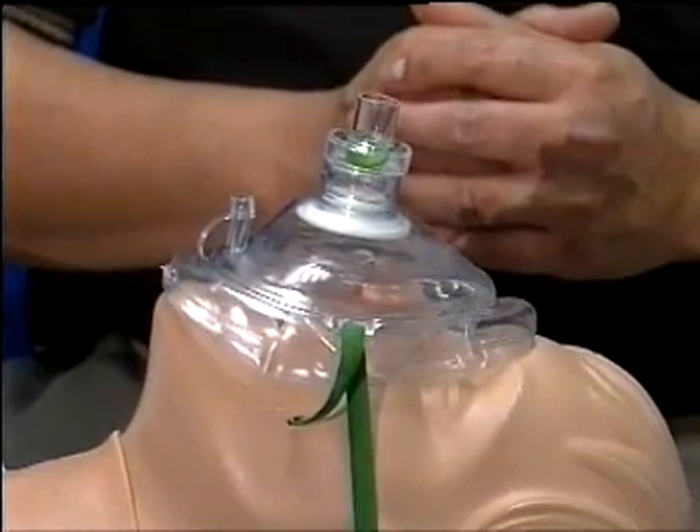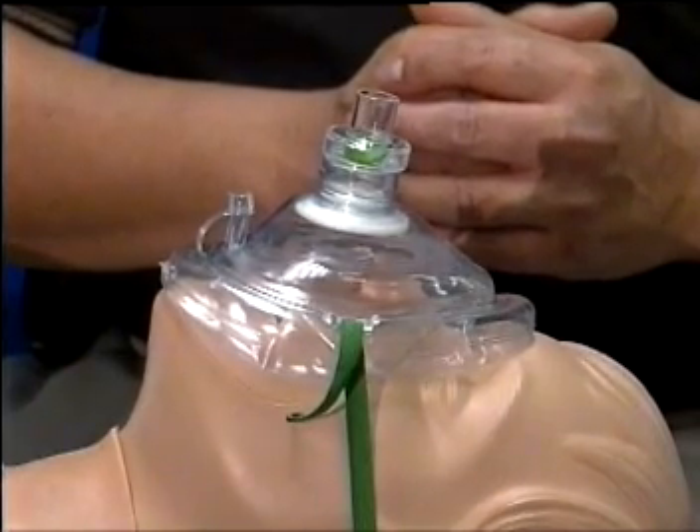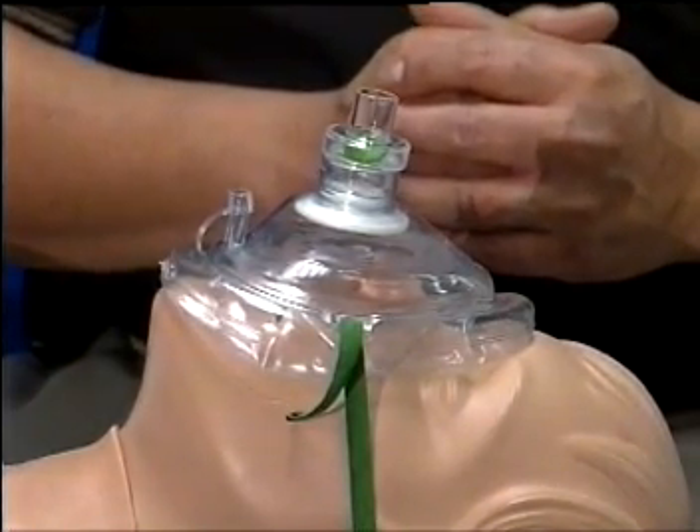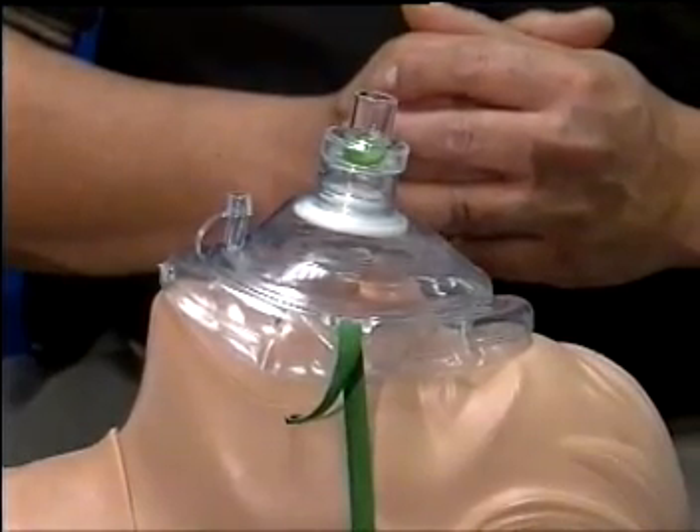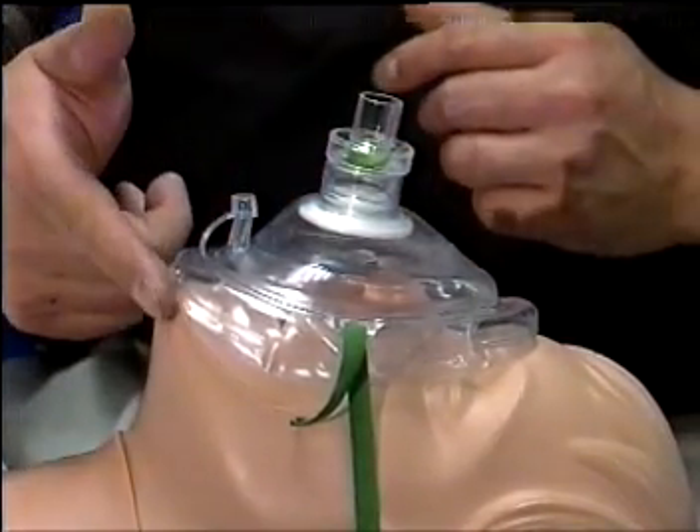The face mask adequately covers the face from below the lip to above the nose. The dome mask design helps to raise and isolate the rescuer from the patient's face and provides simultaneous ventilation through the nose and mouth.